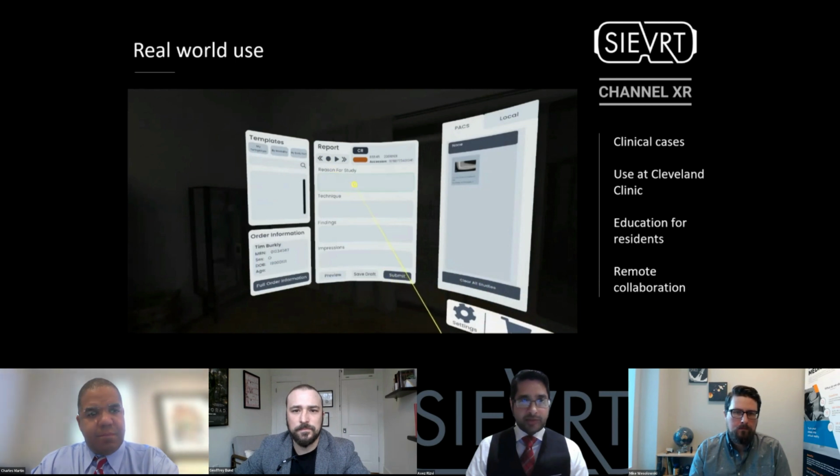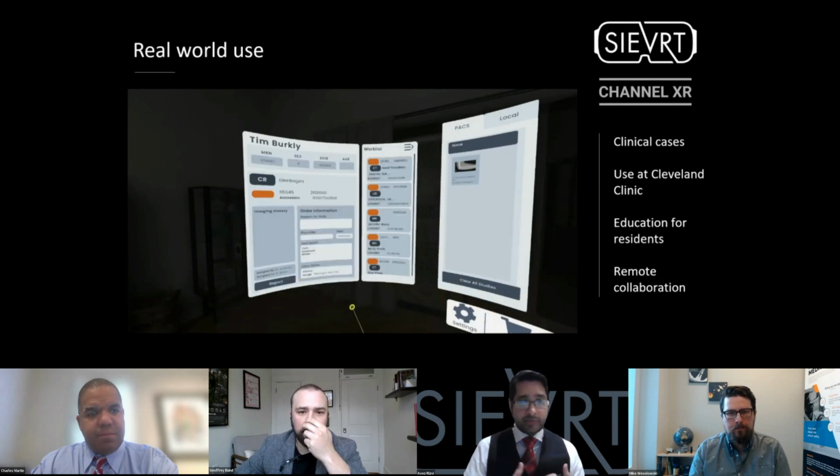In certain situations you don't actually need to have the patient information, for example, just for teaching purposes. Sometimes you don't need to know some of the demographic information for the patient. We also have the ability to remove that demographic information on the back end before it's actually sent to the device, so that if residents just want to go over some cases by de-identifying some of the demographics, we can do that as well.